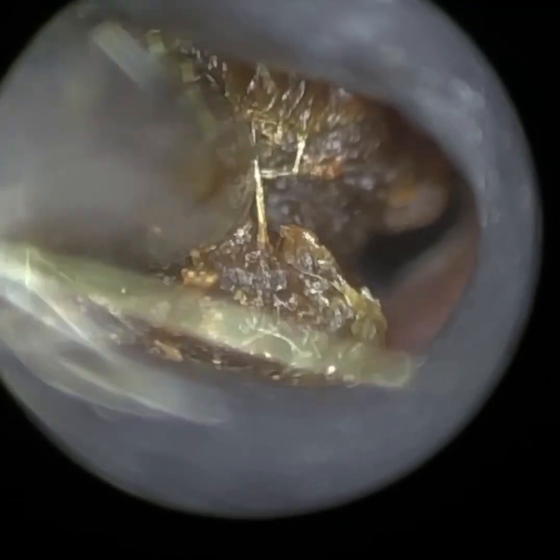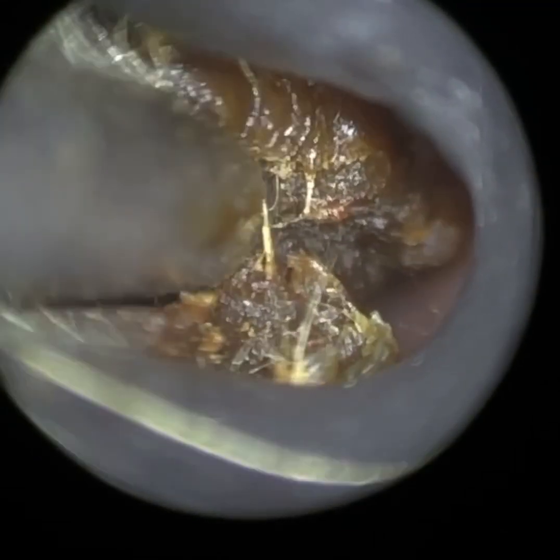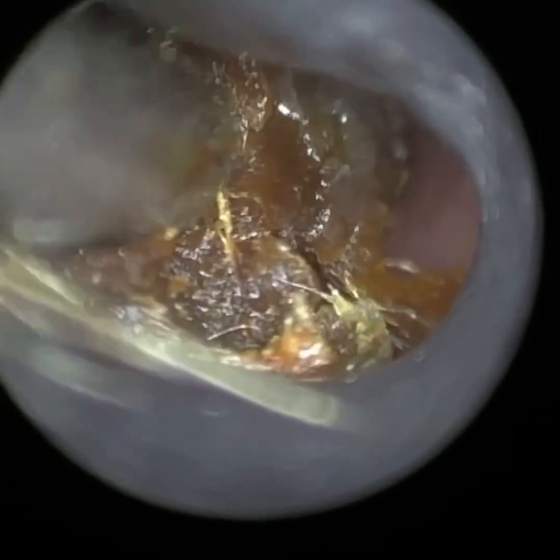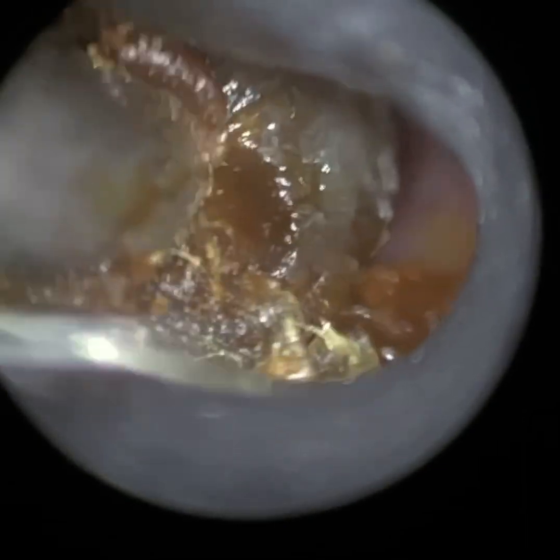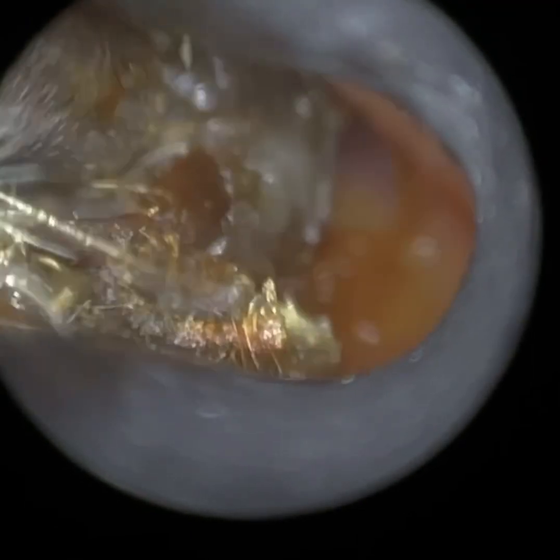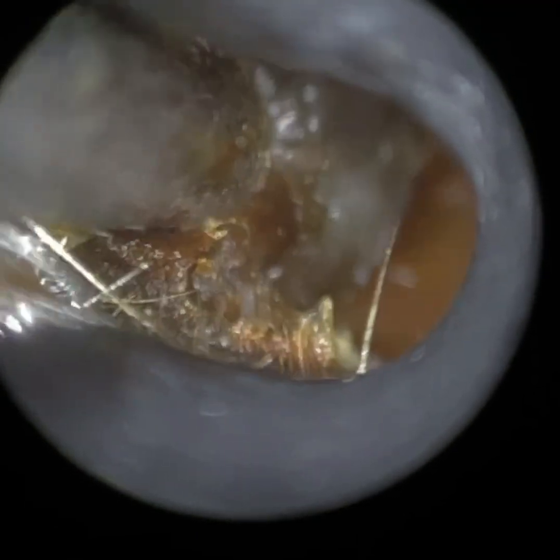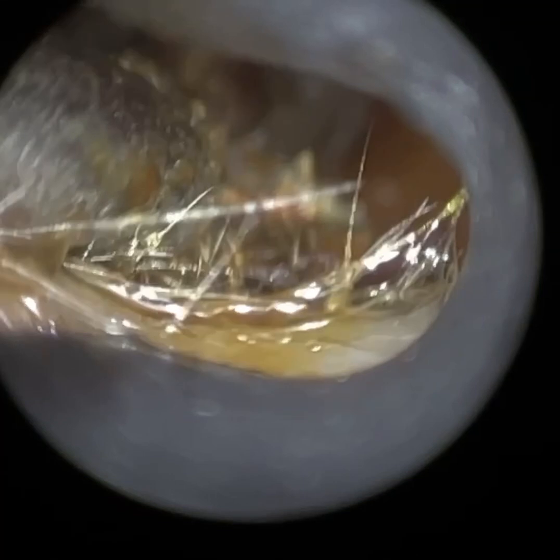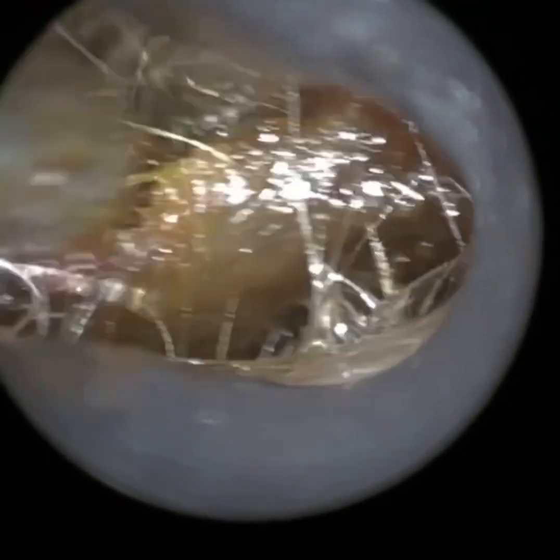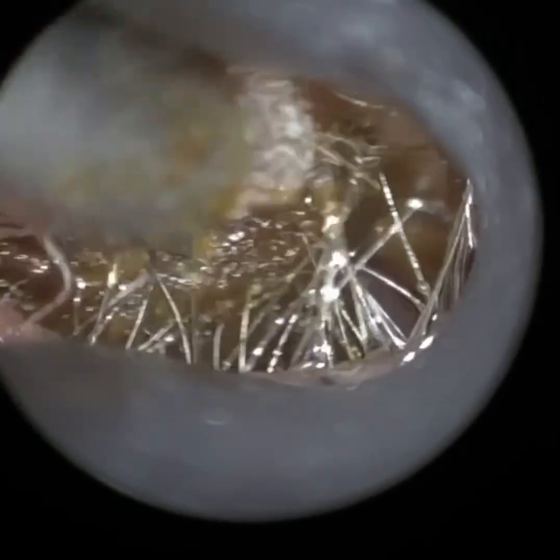It's not going through any mounting system which the speculum is attached to. If you imagine a device where you've got a speculum attached to a fixed mounting system and you're going in and out of that mounting system, that mounting system is potentially a hazard because of all the bacteria and wax from the previous patient, and there's no means of sterilising that. So when developing this, we had it in mind to make sure it's hygienic and you avoid cross-contamination.